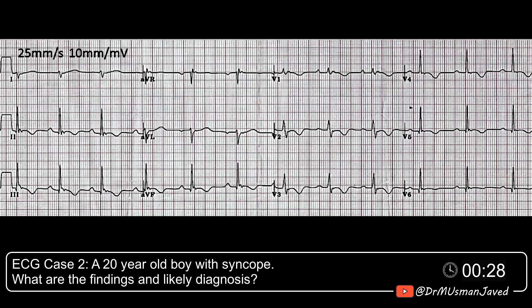This ECG case is of a 20-year-old male being evaluated for syncope. Enumerate the findings in this ECG and the likely diagnosis. Take 10 to 15 seconds to look at it and I will explain the answer.